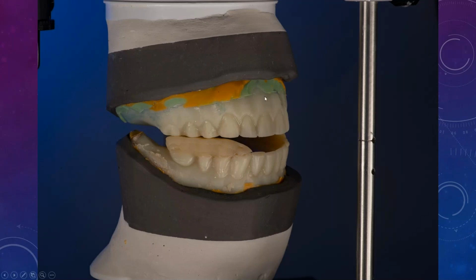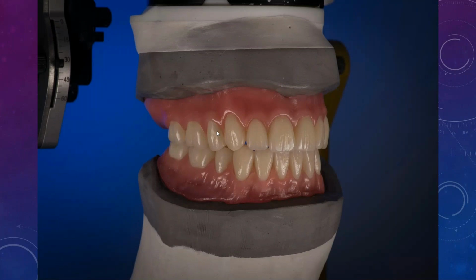Basically what we did, we duplicated the denture, and then we would add a little bit of a bisacryl layer day by day or week by week to bring the patient's vertical back to where they were originally, which is about right here. Then you fabricate a denture, and have them wear it for a while to see how well they tolerate it. If everything's okay, or maybe we need to close that bite up again a little bit, maybe they can't tolerate such a huge opening, then and only then you should do implant placement, guys.